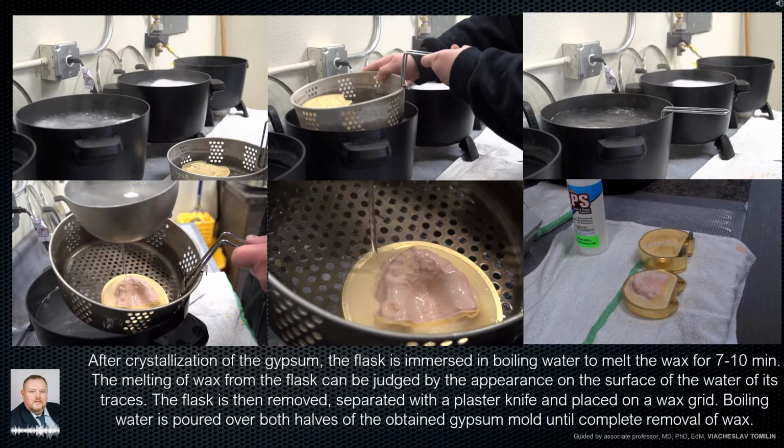Knead the plaster and fill the base of the flask in small portions. After crystallization of the gypsum, the flask is immersed in boiling water to melt the wax for 7 to 10 minutes. The melting of wax from the flask can be judged by the appearance of its traces on the surface of the water. The flask is then removed, separated with a plaster knife and placed on a wax grid. Boiling water is poured over both halves of the obtained gypsum mold until complete removal of wax.